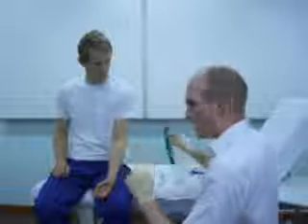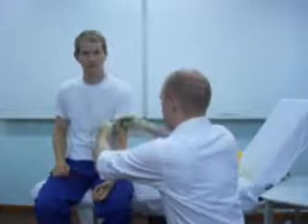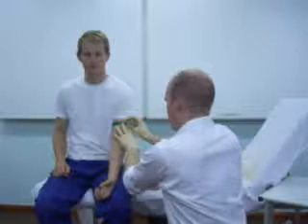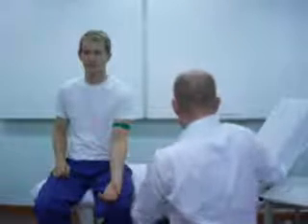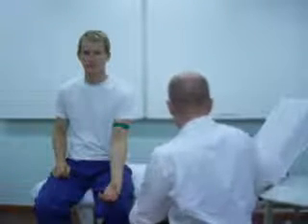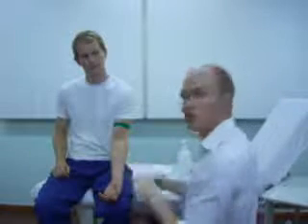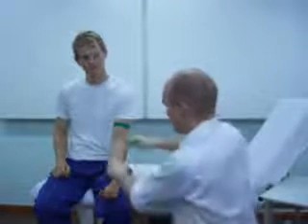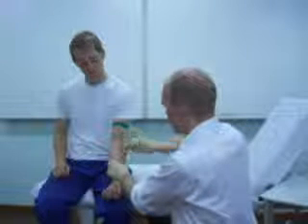Moving on to it, wearing gloves obviously. First thing to do is to put the tourniquet around the patient's arm. For this, I'm going to use a vein in the antecubital fossa, nice and easy to access. We've got all our equipment here, including a sharps bin. So I'm just going to clean this area now using a sterile cloth.